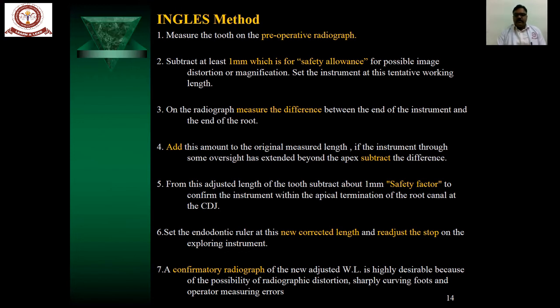And again, you will face extra challenges like curved roots, which will be difficult to manage if you lose your working length. There are possibilities of a perforation or ledge if you don't spot the curved roots at the beginning of your procedure.